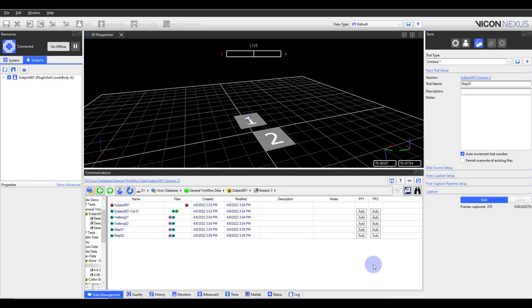When reference video is initially captured, it is saved in a raw format and typically on a solid state drive. Therefore, it is necessary to transfer the video files after capturing to convert the raw files to AVI format and to move them to the appropriate session folder so they can be viewed in Nexus.